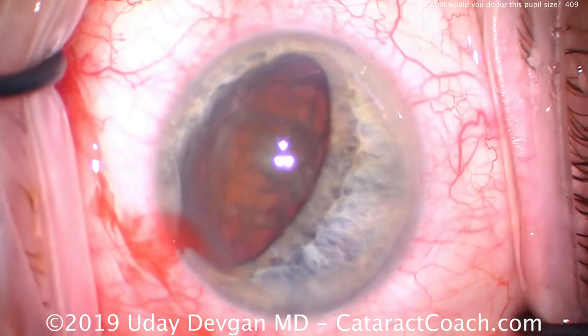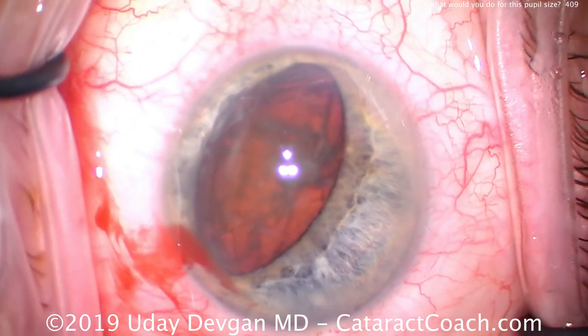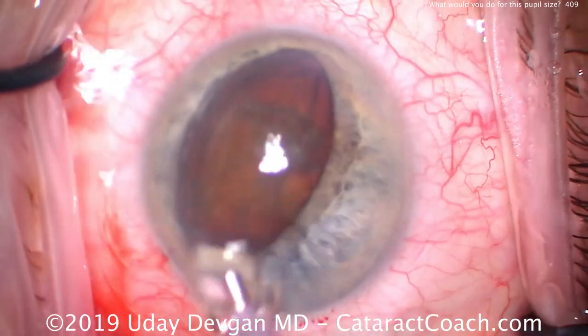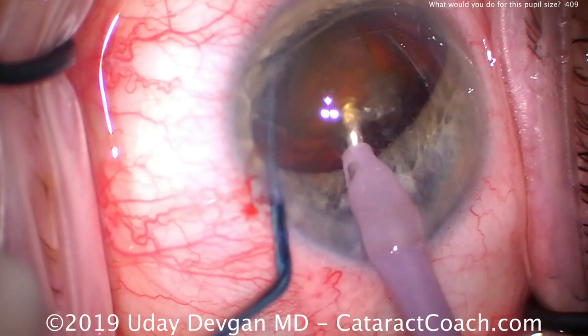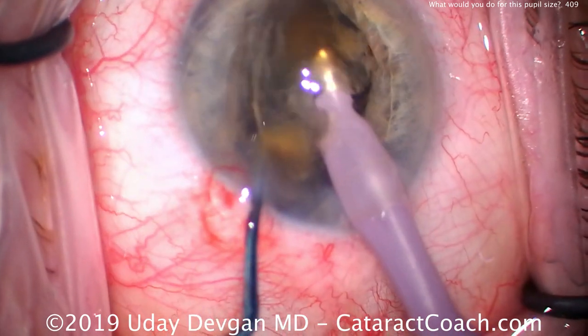The nucleus itself is holding the pupil open and keeping the iris away, preventing it from flopping around. The iris is holding the nucleus so the nucleus stays still. We can buzz in here with the phaco probe, get the chopper around the other side, and chop it into two halves right away.